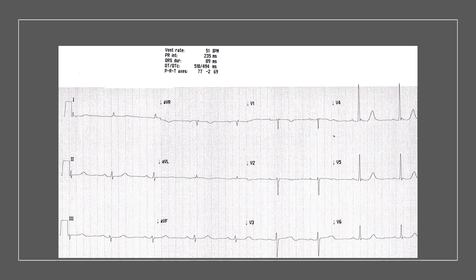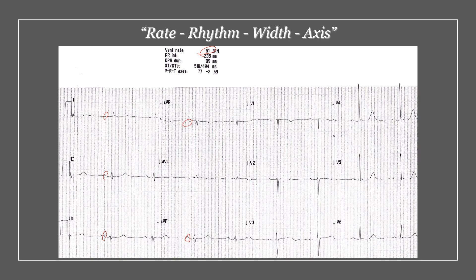Here's our ECG and let's start with the first four questions about the complex. What's the rate doing? What's the rhythm doing? What's the width like? And what's the axis doing? Looking at the rate, the rate here is 51. So we are on the slow side, we're on the brady side. And looking at the P waves, we've got an upright P wave in the limb leads and we have got an inverted P wave in AVR. So that is a sinus rhythm — we have sinus bradycardia.